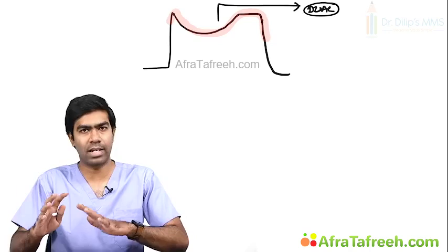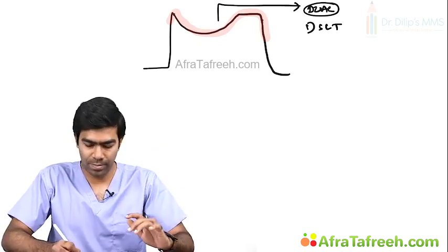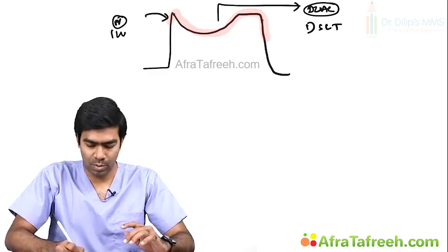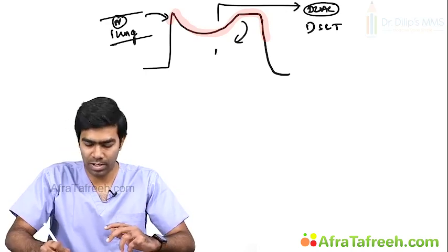If they ask what conditions result in a dual capnogram, many conditions can cause it. Condition number 1, which I always expect in the exam, is single lung transplantation, where the first curve is the CO2 elimination from the normal lung. The second peak is due to CO2 elimination from the diseased lung.